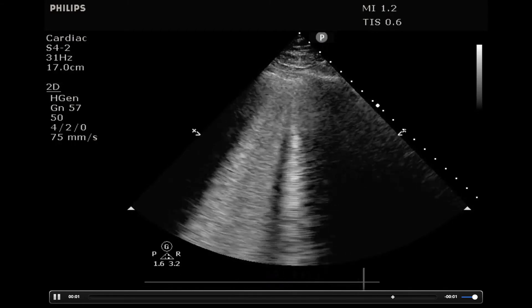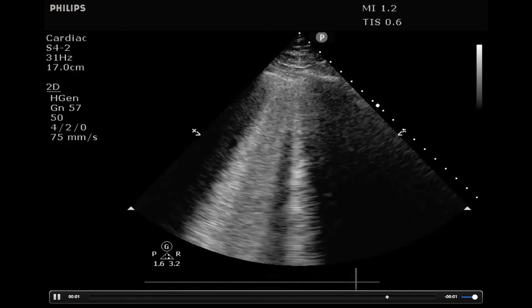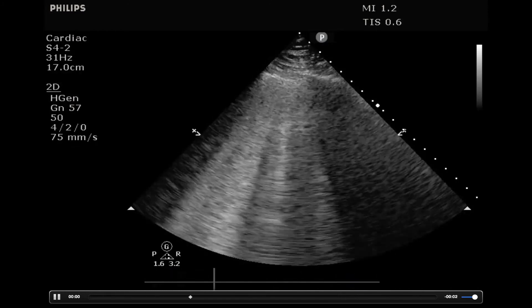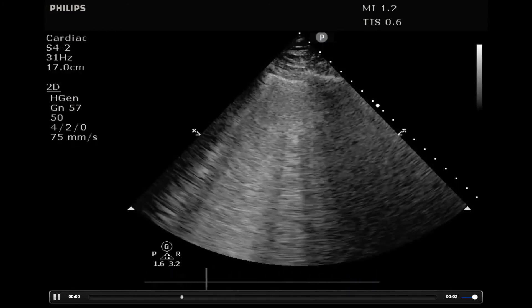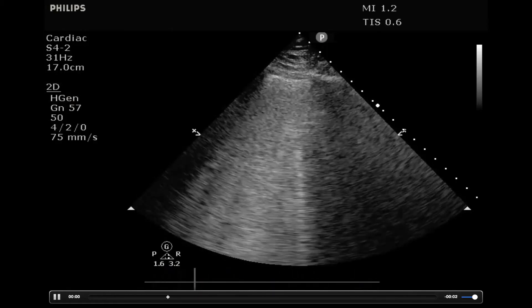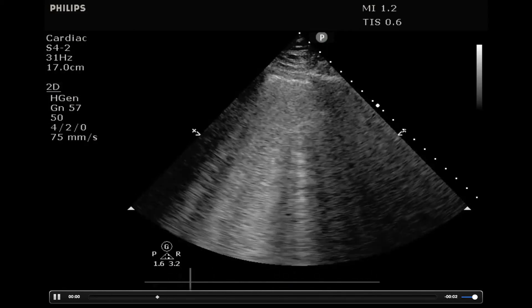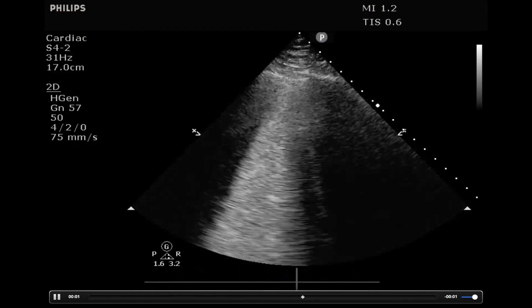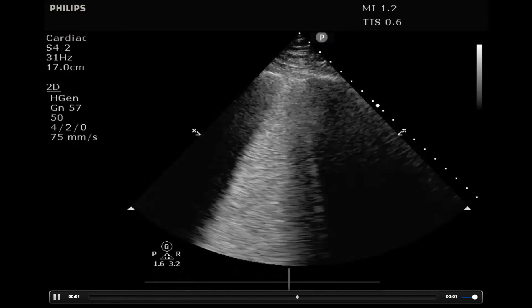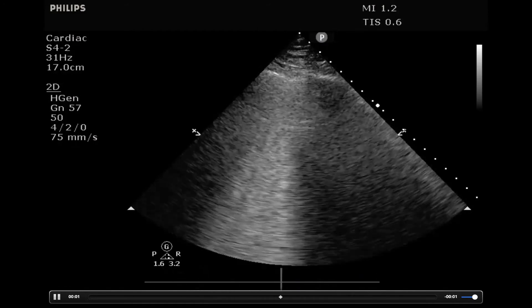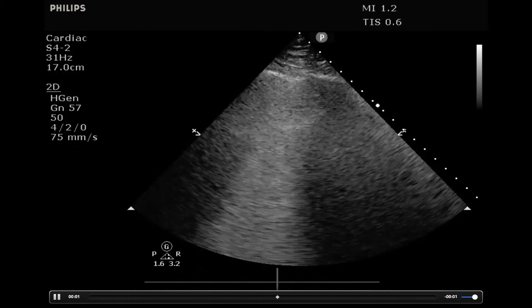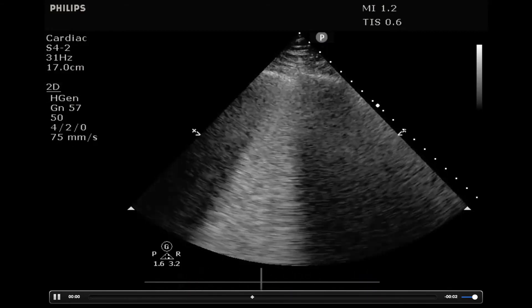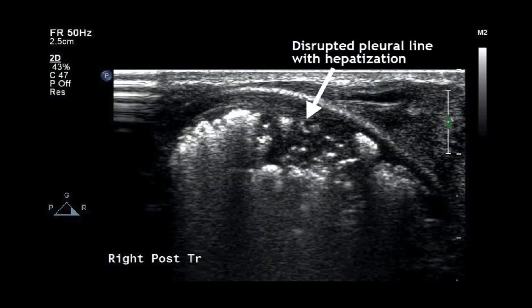Anything that thickens the interstitial tissue or puts fluid in it will cause a B-profile. It's important to assess whether B-lines are unilateral versus bilateral, focal versus diffuse, because this has implications for etiology. A patient with cardiogenic pulmonary edema will have diffuse B-lines bilaterally throughout the entire lung fields, whereas someone with viral pneumonia may have a patchy appearance — bilateral or unilateral, in certain places but not others. Patients with pulmonary contusions will have B-lines only in the area of that contusion.